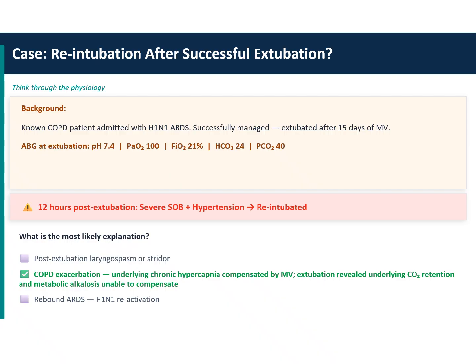But once we extubate, we see some patients deteriorating within a few hours or a day and getting reintubated. And believe me, most of the time we label it as a possible glottic edema. We would have done the cuff leak test, and the patient will have a good cuff leak also, but we label it as glottic edema. And the moment you are reintubating, you will always see a glottis which is erythematous or edematous, because the patient has been intubated for very, very long. So this is one of the biases we have.